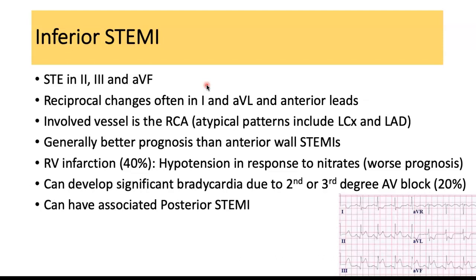These patients can develop a significant bradycardia due to second or third degree heart blocks and can have this associated posterior STEMI or right-sided STEMI. So let's look at a few different tracings.